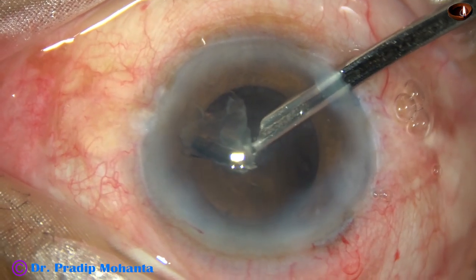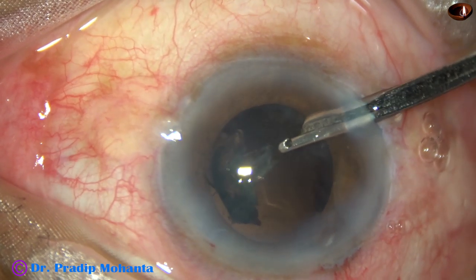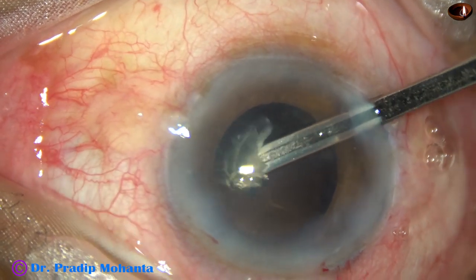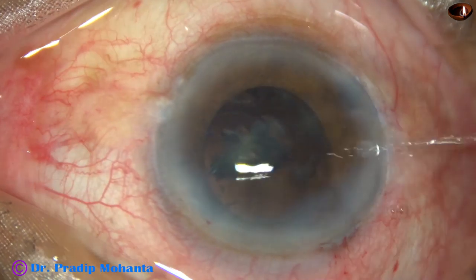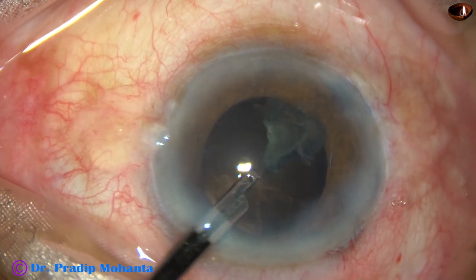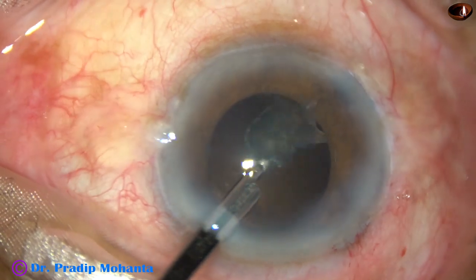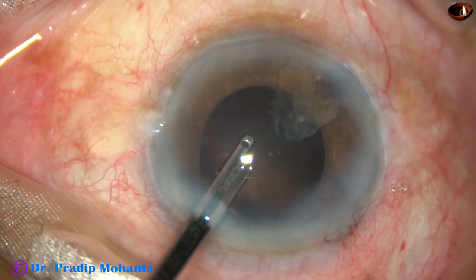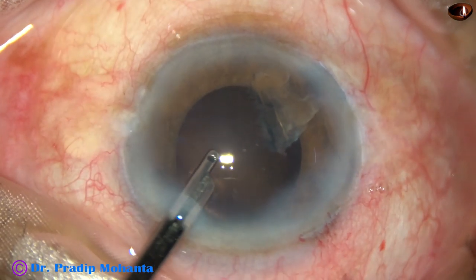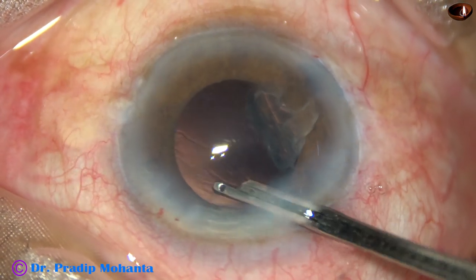Before implanting the intraocular lens, I am removing cortex because the pupil is not fully dilated. If I implant the intraocular lens first and then try to remove the cortex, it will be difficult. What is happening is that this small nuclear piece is frequently coming to the aspirating port and blocking it. So I am frequently regurgitating so that the piece doesn't come to the aspirating port, and in this way I could remove the cortex very nicely.